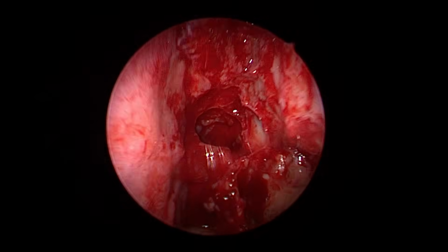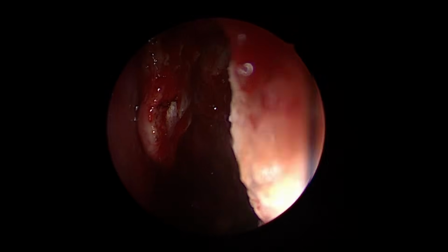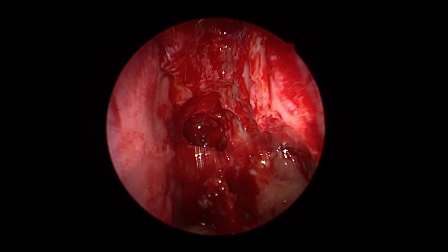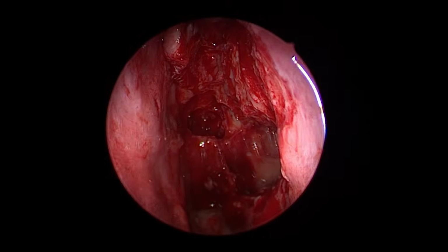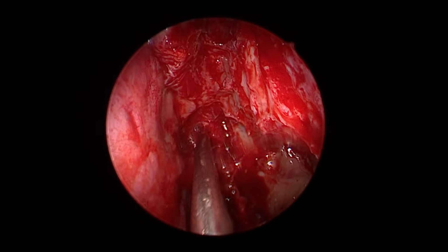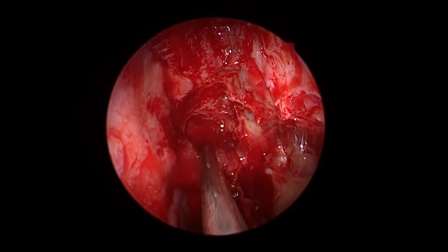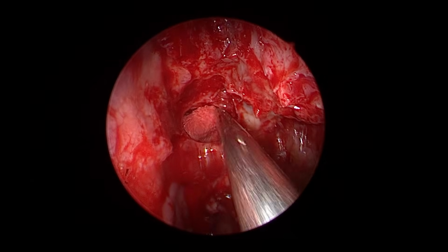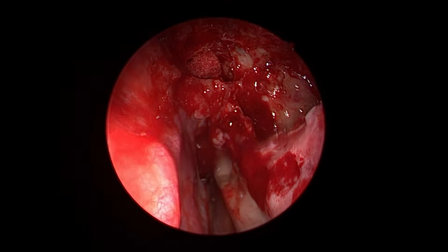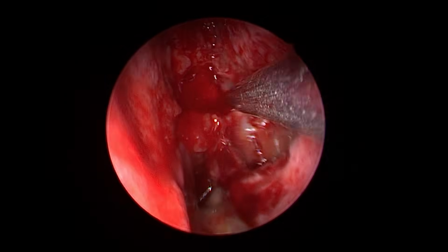See the wide sphenoid, wide maxillary, wide frontal, complete ethmoidectomy flush to the orbit and medial wall here, and you put your 0 degree and this is full house FESS. Full panoramic view of paranasal sinuses. Once done adequately, never required a revision, because now there is no scope of further bone work. You have reached the limits.